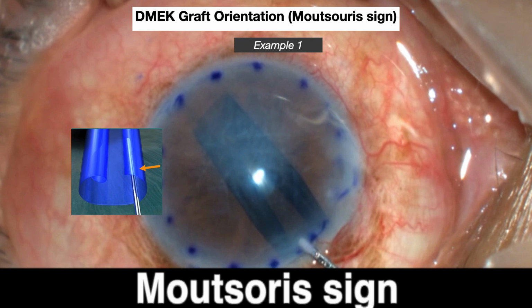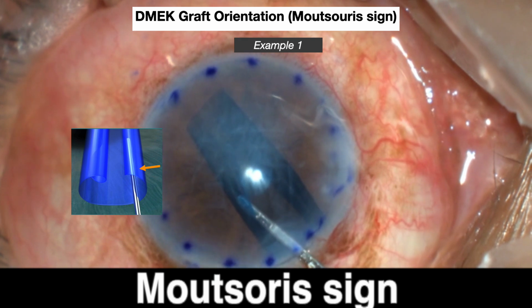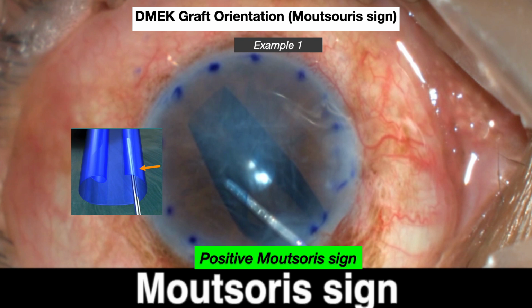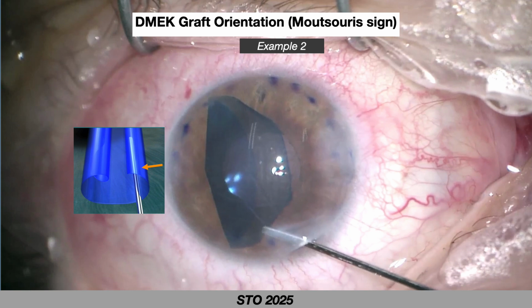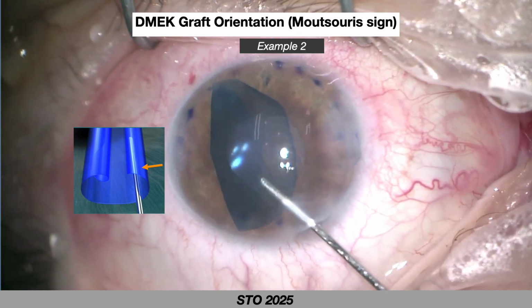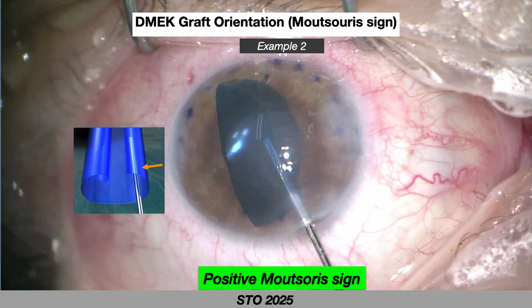This is an example of Moutsouris sign positive. You see, you put the spatula over the graft and then move it sideways, and you find that the spatula disappeared under the DMEK roll, so this means that it is a positive Moutsouris sign and you have correct orientation. Another example: we want to know whether this fold is facing toward me or toward the iris. So put your spatula above the DMEK graft and watch. You see, it disappeared under the fold, so this is a sure sign that it is a correct orientation.